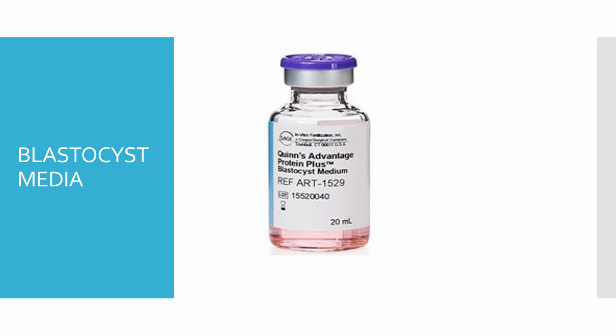Human serum albumin. Albumin is a naturally occurring transport protein found in the body. Commercially available albumin is fractionated from plasma or blood from donors. Common sources of macromolecules and proteins for culture media include human serum albumin. Albumin is thought to maintain the stability of cell membranes and chelate trace amounts of toxic components present in culture media components and culture dishes. Other functions include capillary membrane permeability and osmoregulation.